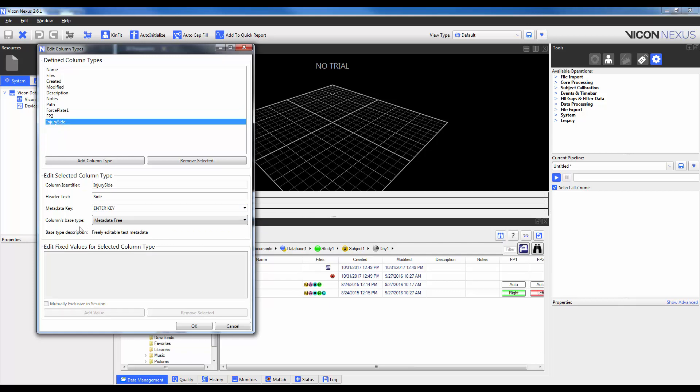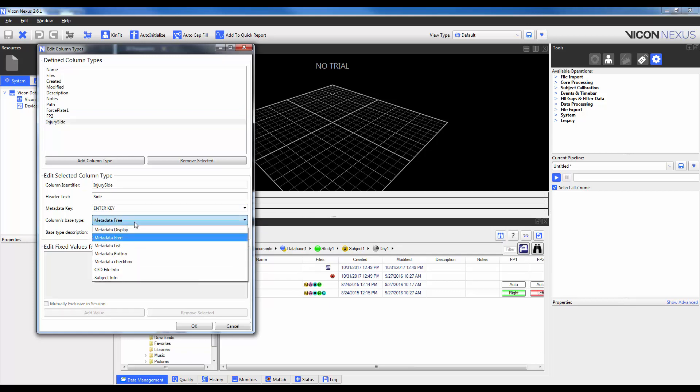I'm then going to go ahead and select a Column Base Type. And you can see here there's a long list of selections. Display and Free are similar and allow a user to type in any text that they would like into that box. I'm going to show you an example of List and Button here, so I'm not going to talk about those just yet. A checkbox will allow the user to put in a checkbox so that they can say whether or not something is either true or false. And then you can also choose to extract information from the C3D or the VSK directly.